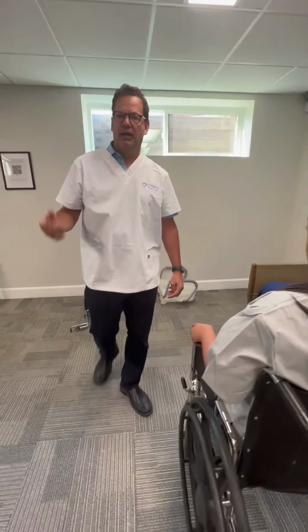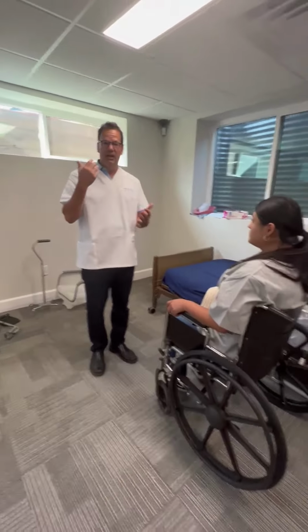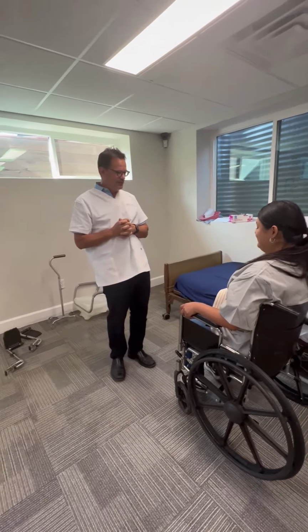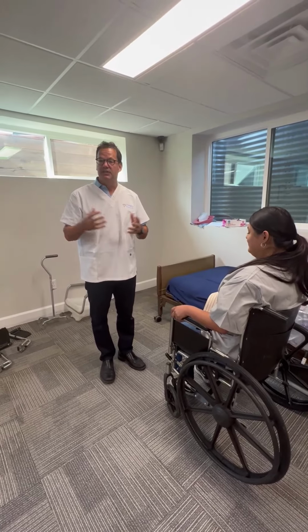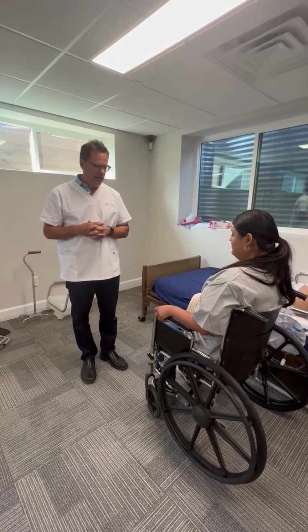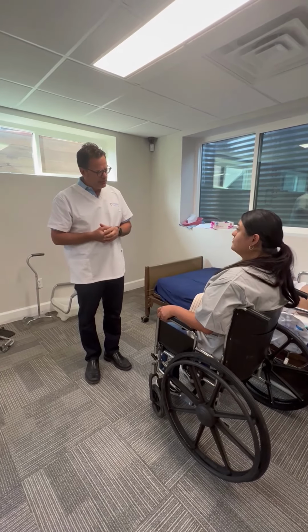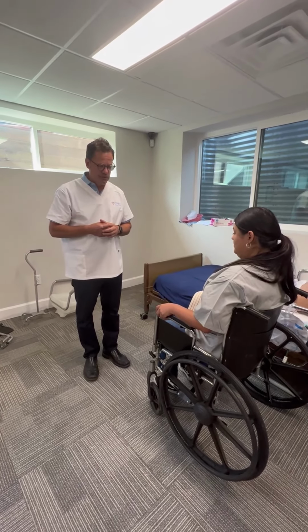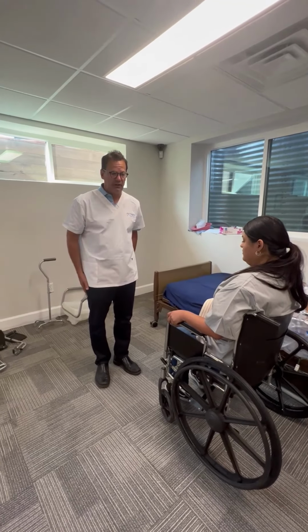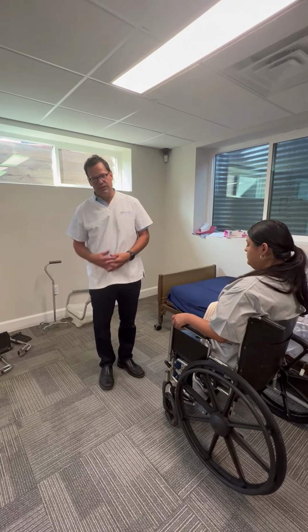So again, the key steps. Actually, in this case, Giselle is eager to get to the chair. She's been transferred before, but I still stopped. I asked her how she was feeling before we pivoted. And once we pivoted, we then started to take a few steps back. She felt the chair on her legs. She reached back and sat down.